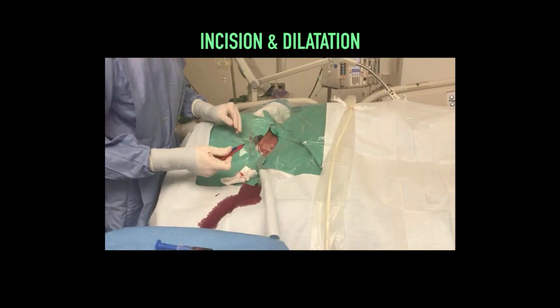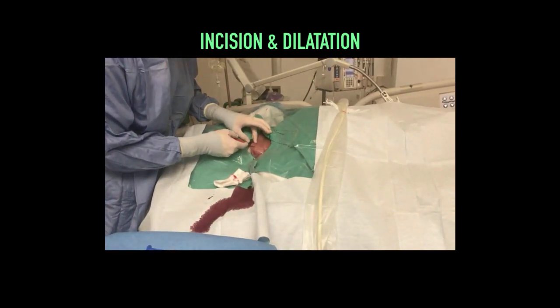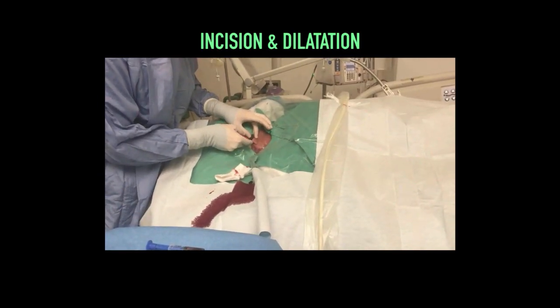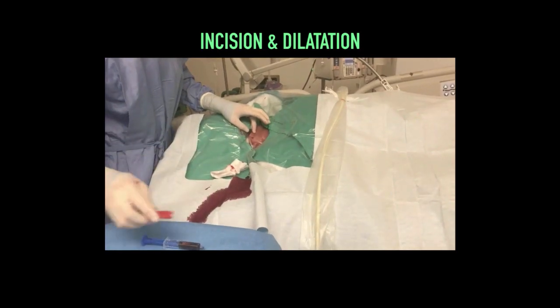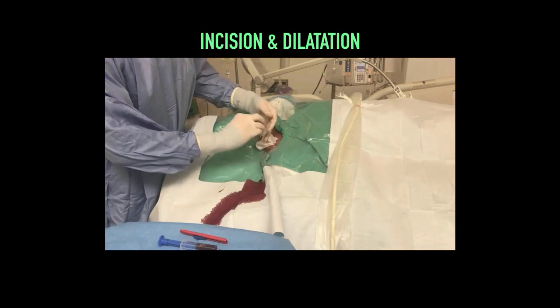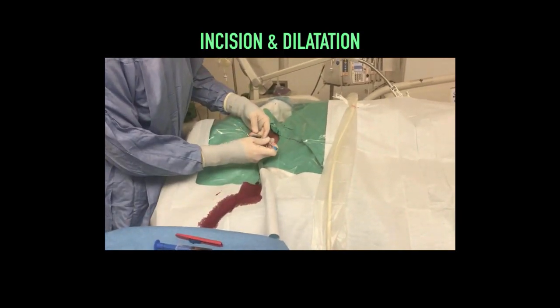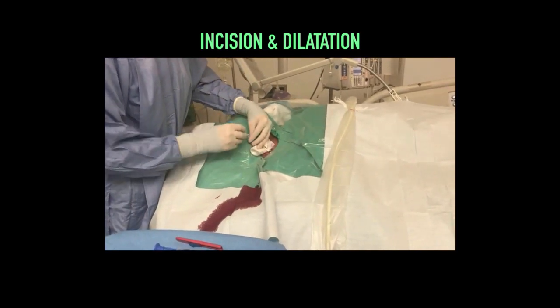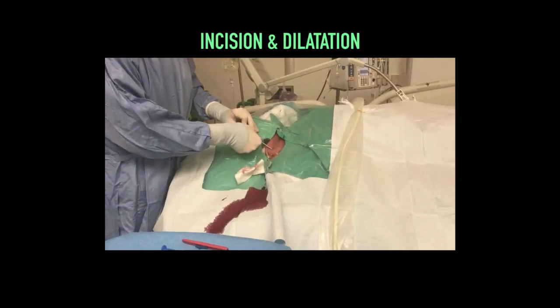Next, moving on to incision and dilatation. An 11 blade is used to make an external nick in the skin, just to allow introduction of the dilator and catheter, being careful to avoid nicking of the wire. Next, simultaneous compression and preparing the wire for the dilator. You'll notice the operator is careful to control the wire at all times.